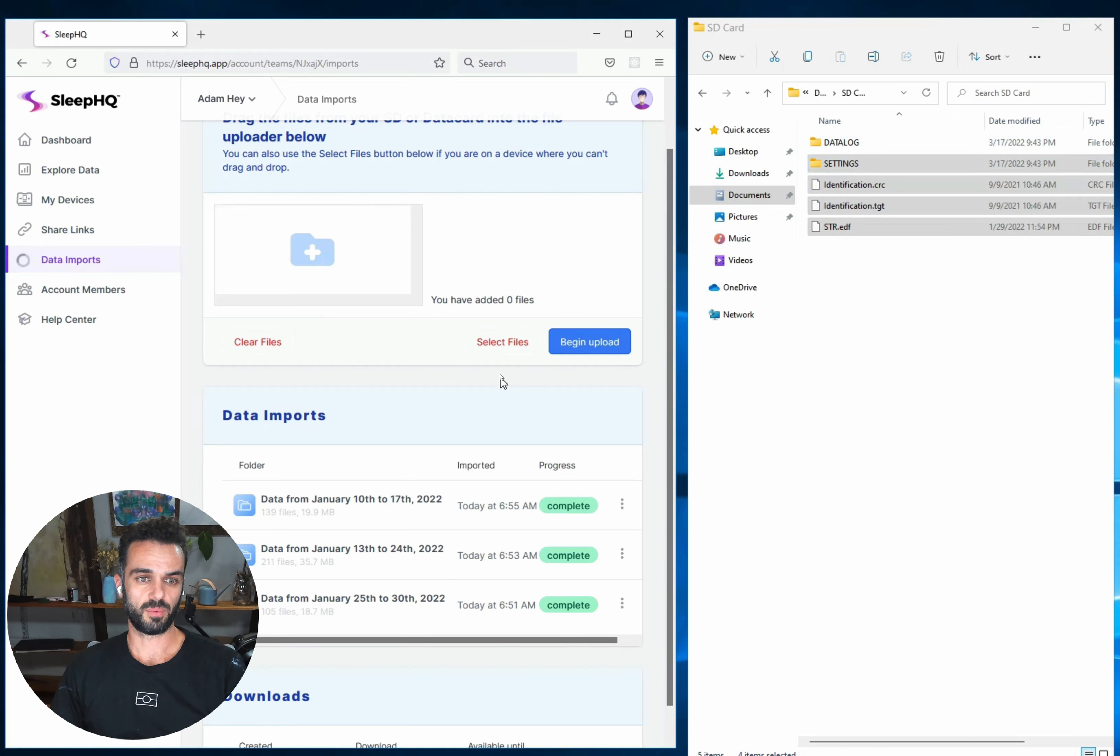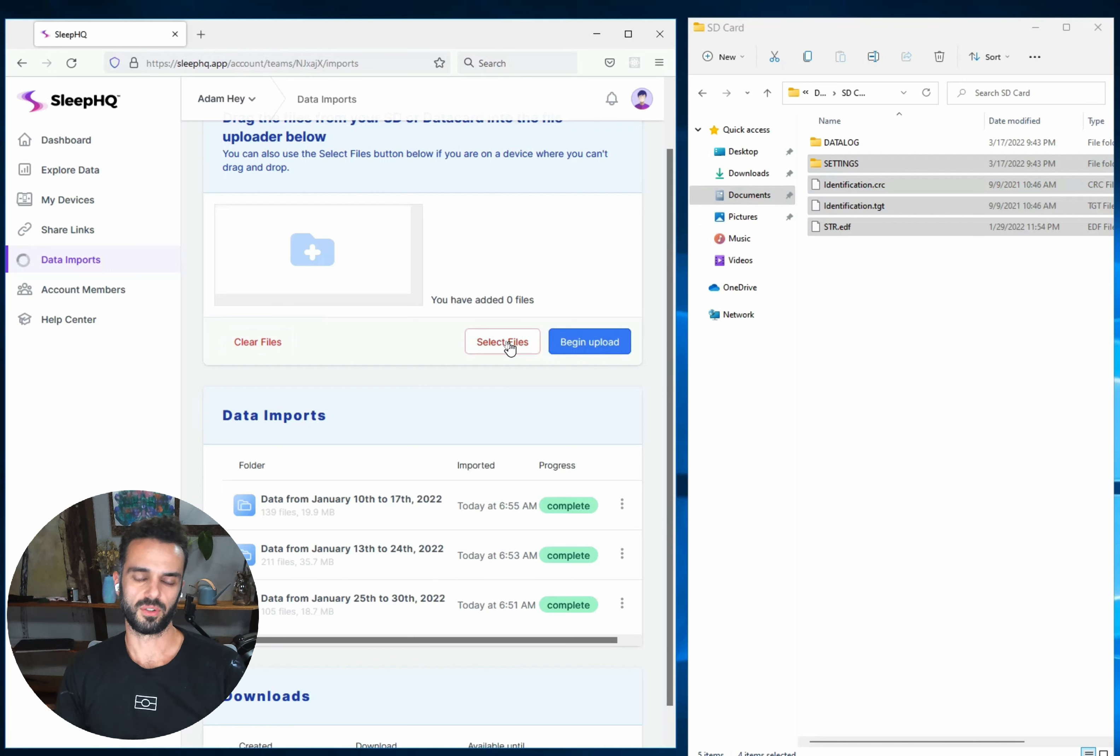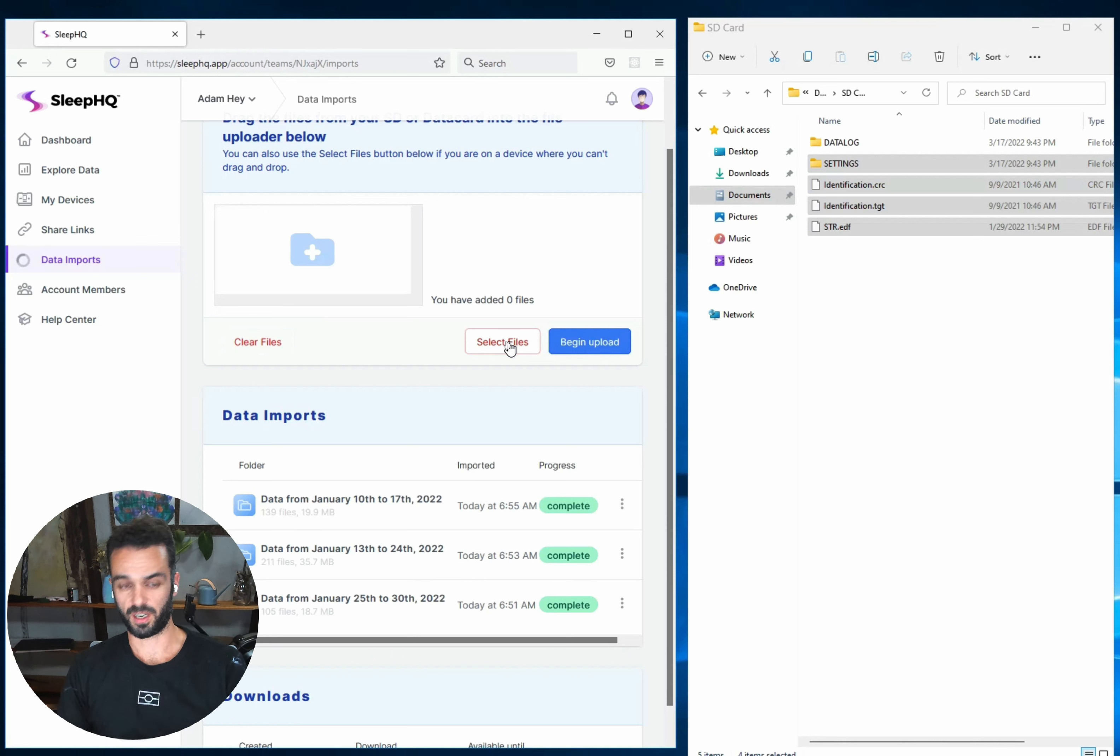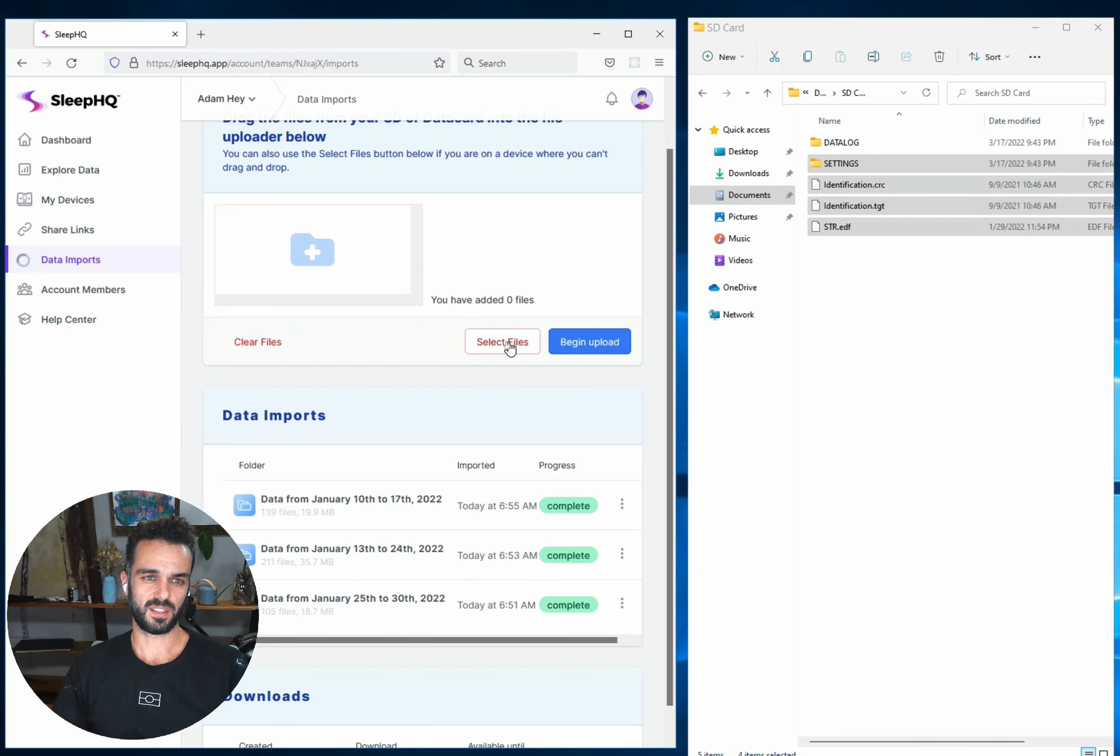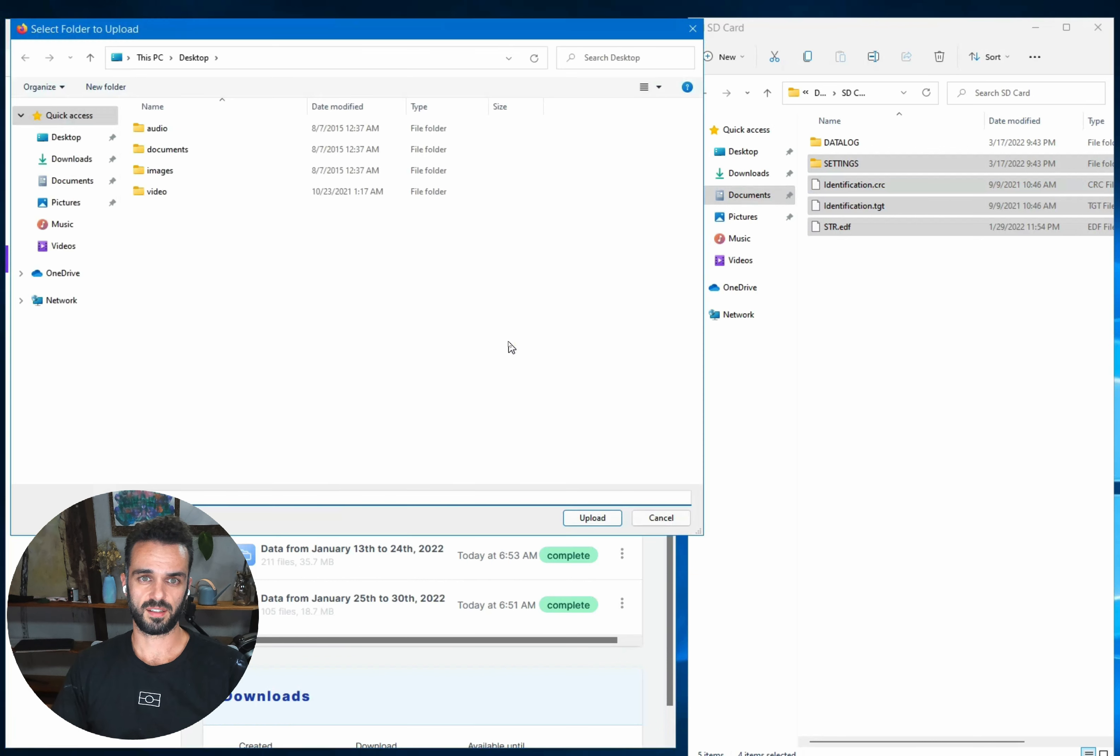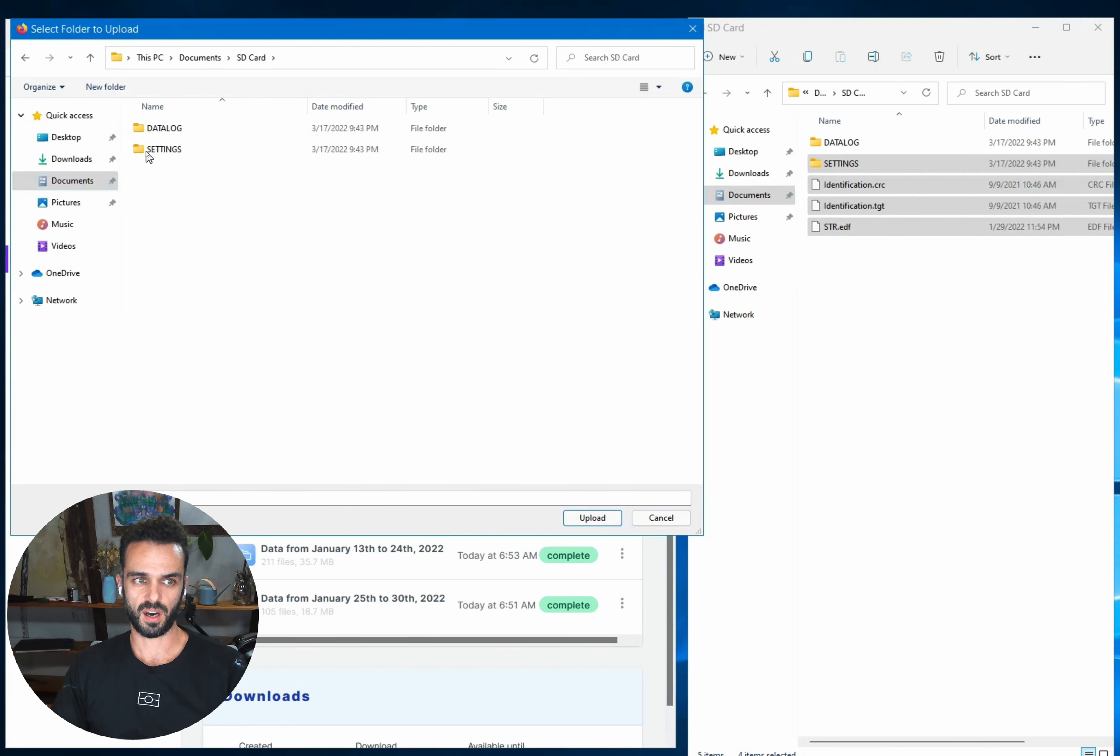So they're the main things to watch out for. One other really important thing is this select files button. This button is really only here for people who can't do drag and drop. If you're on a device where you can't drag and drop like an iPhone, then you're going to need to use the select files button. The problem with it though, is that depending on your operating system or depending on the browser that you're using, you might only be able to select one folder at a time and you may not be able to select the files.